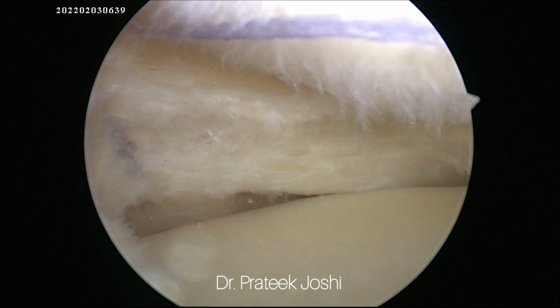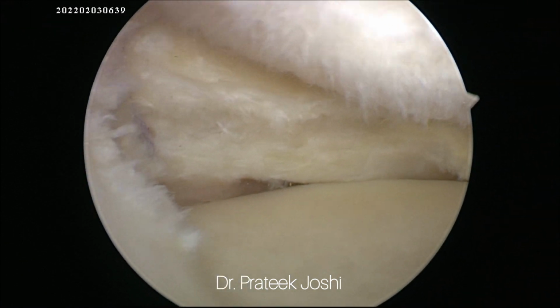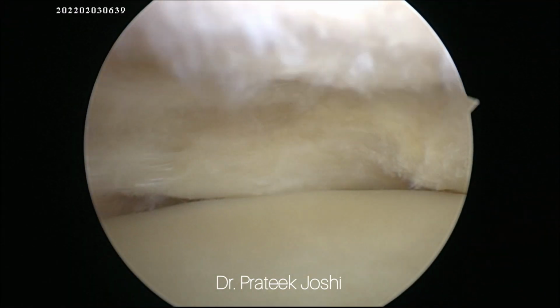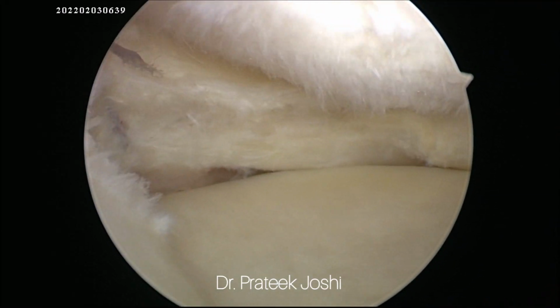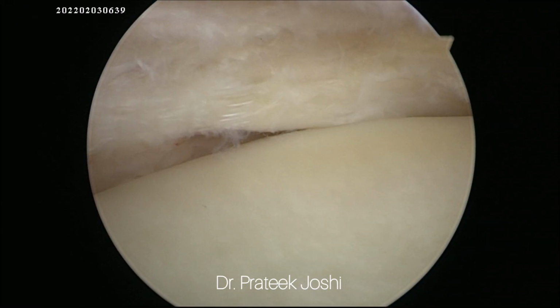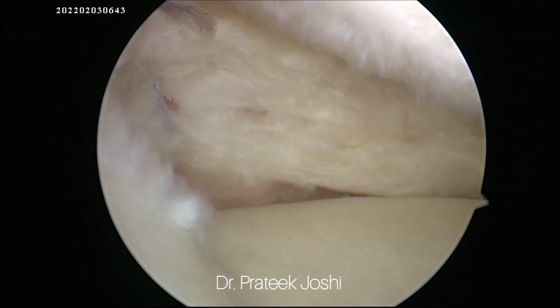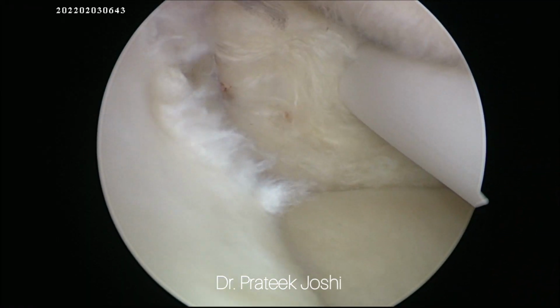Before that, I have introduced my arthroscopic probe to correct the alignment of our suture, and now I've cut my thread, so this completes our first stitch. Now I'm going to repeat the same steps 1 centimeter or half centimeter posterior to our first stitch. So as you can see, I have again pierced the superior capsule with the help of the all inside device.